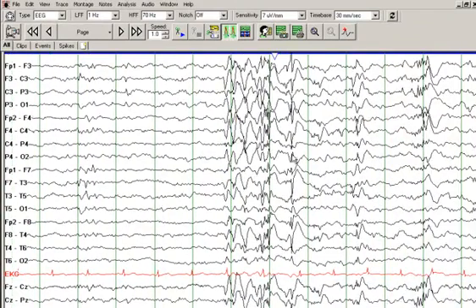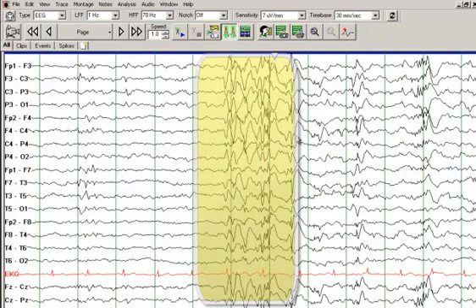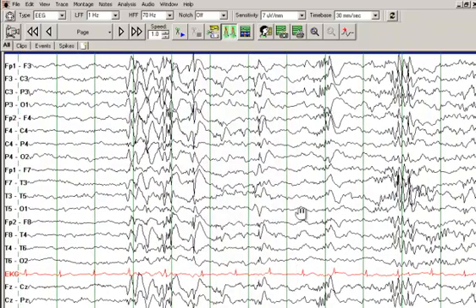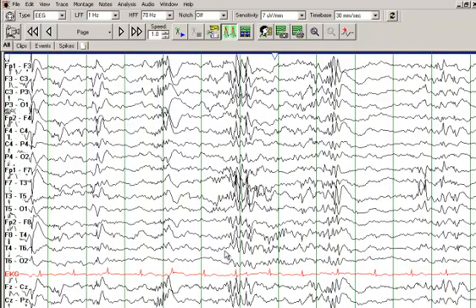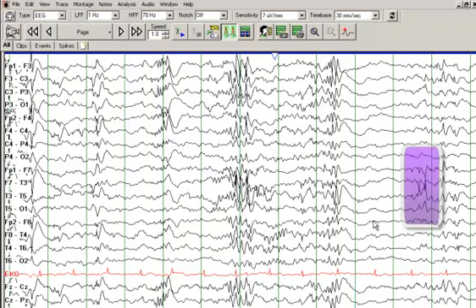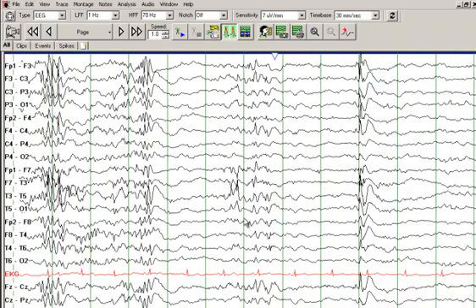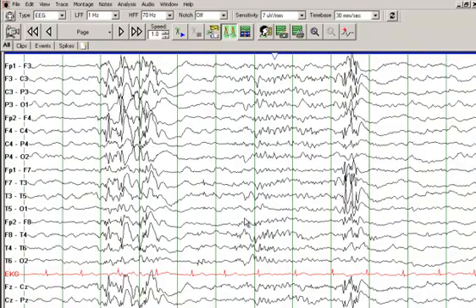Moving on, you see generalized bursts of slowing and sharp waves. These are slow spikes and multifocal spikes. These are generalized bursts of sharp waves with maximal amplitudes in the frontal and temporal head regions. On this page, this is most prominent on the left hemisphere, with a sharp wave seen on the left side as well. The background is slow; we see generalized bursts of sharps, slow spike-and-wave, and polyspike-and-wave discharges in a generalized distribution.